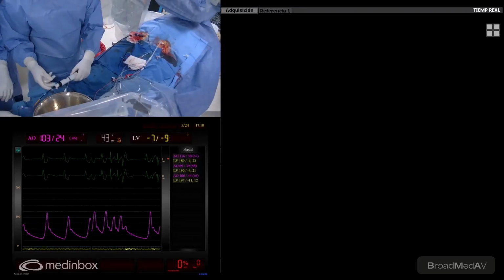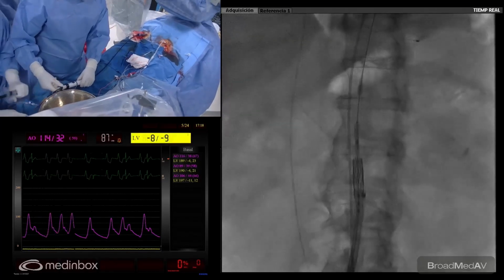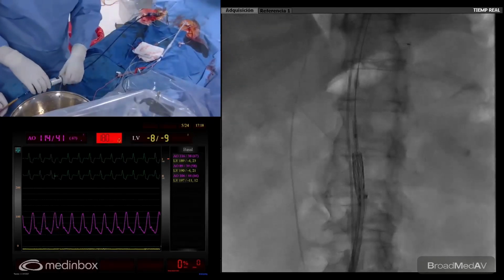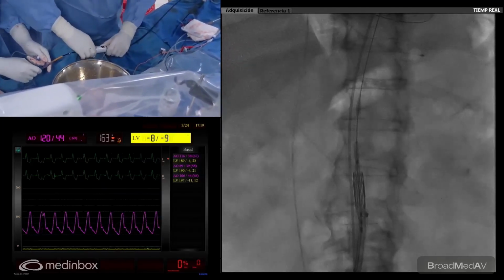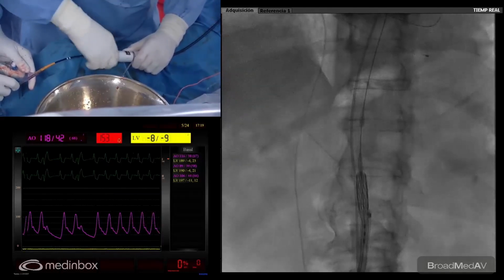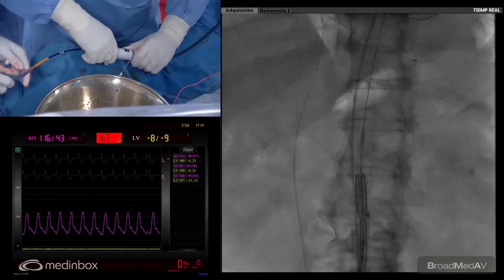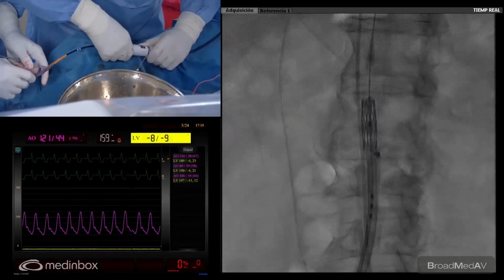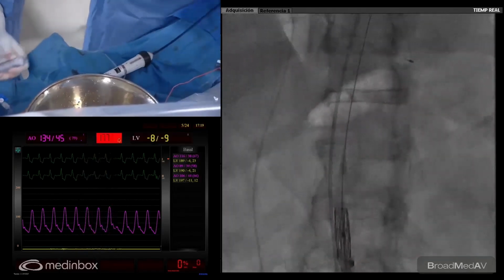Now we have to go to fine adjustment. We can go by zoom now. Okay, there. Now we are going to introduce the balloon in. The patient is so big that the image we have is not that good. Please zoom one more. Okay, so now I think we are okay. You agree? Yes. Perfect. Let's go. Let me move this, show me above.